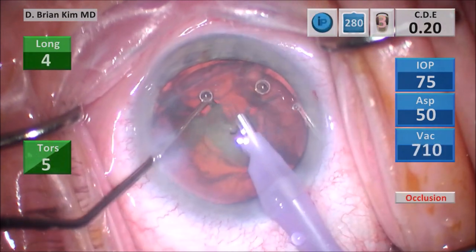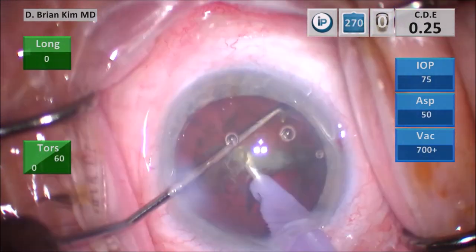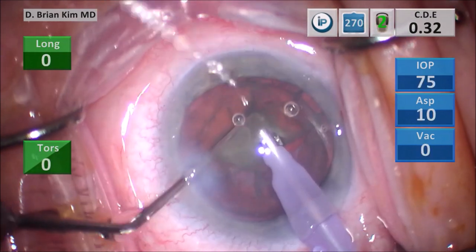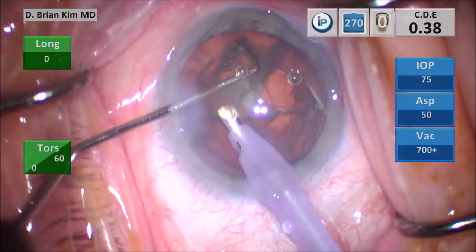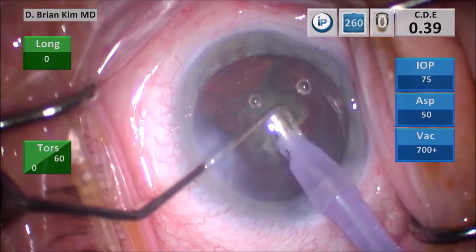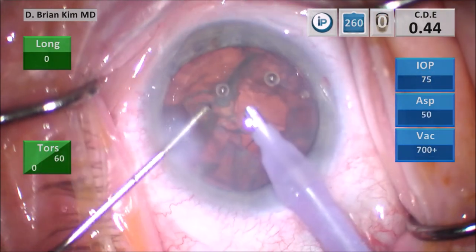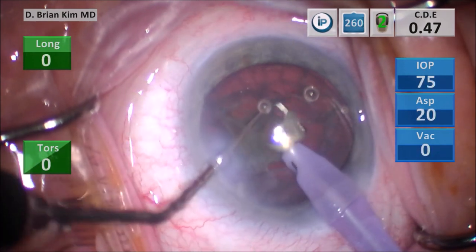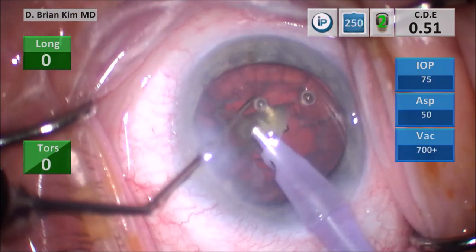This is about a one to two plus dense lens — not too bad. I've removed half the lens, moved the heminucleus in front of me, took the chopper out to the equator, and sandwiched the lens material between the chopper and the phaco tip, crushing it, and once I have bite-sized pieces, emulsifying the lens. This is the last quadrant. I'm crushing against the lens material, sandwiching it, and then emulsifying when pieces are small enough. The CDE is fairly low — a fairly routine case. I'm making sure the chopper is deep between the posterior capsule and the phaco tip as I finish the remaining endonucleus.